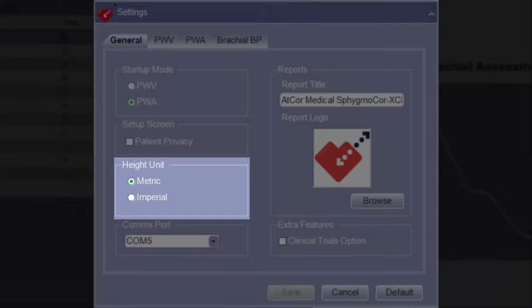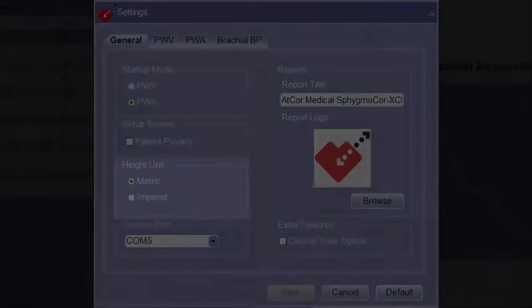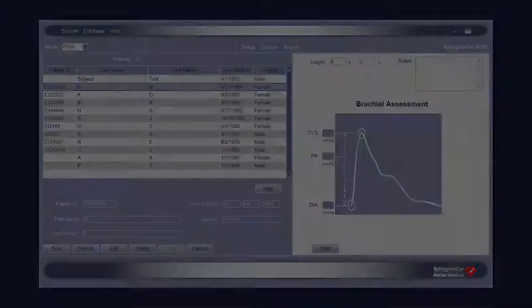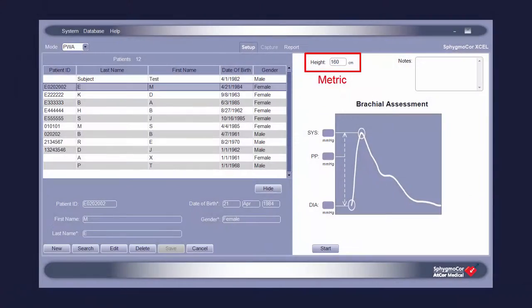The Height Unit option allows for the choice of Imperial or Metric as the units of measure when entering the patient's height. Select Imperial to enter the patient's height in feet and inches, or choose Metric to enter the height in centimeters.